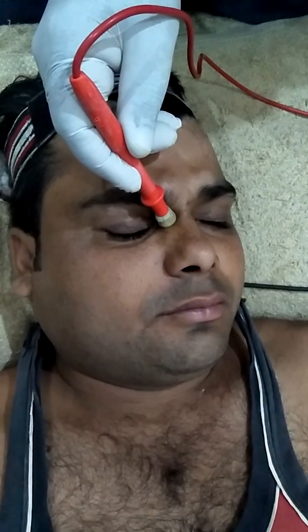You can increase the intensity slowly. Relax. You see the contraction of the nasal muscles and also the orbicularis oculi muscles. Okay, increase this. No, it's fine.